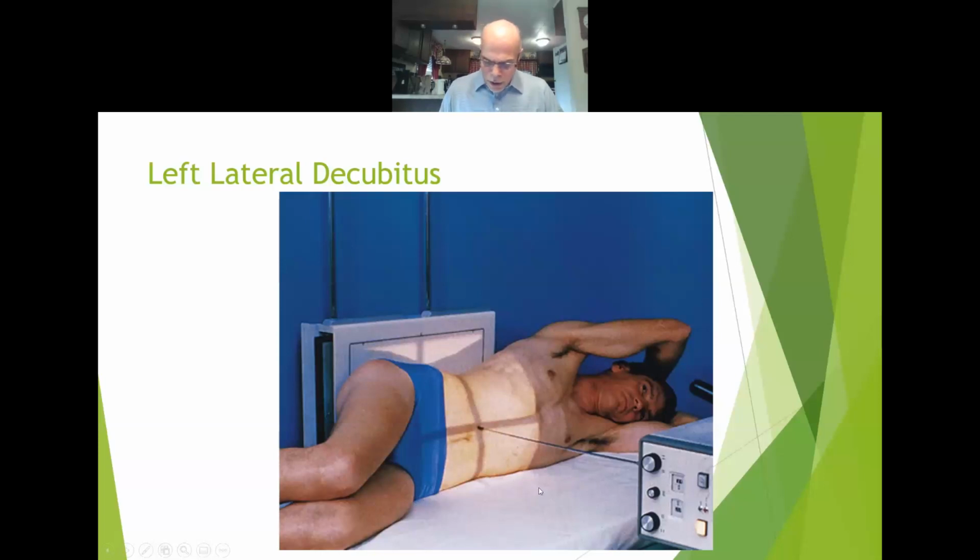Okay, the next thing we talk about, it says if free intraperitoneal air is suspected, have the patient lie on the side for 5 minutes before the exposure to allow air to rise to the highest level in the abdomen. Have the arms above the level of the diaphragm. Just get the arms up and out of the way. Flex the knees slightly to help stabilization. The knees are on top of themselves and flex.